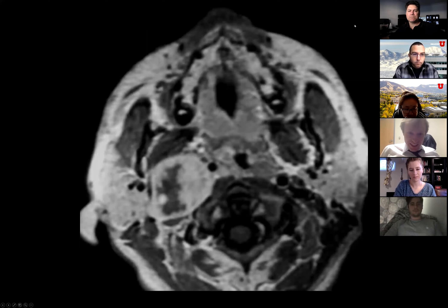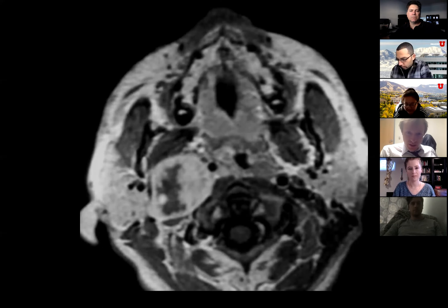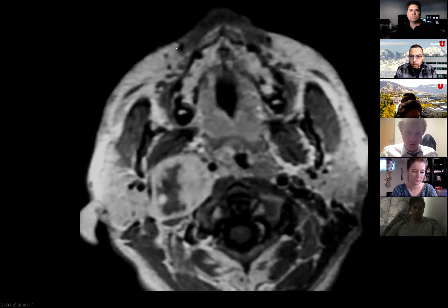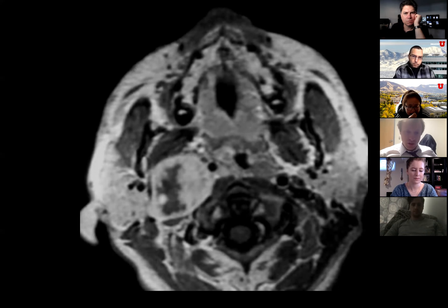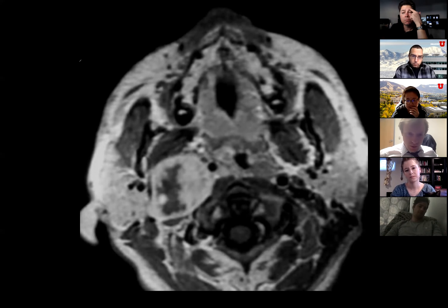Looking at a T1 image, I see a round mass centered in the right carotid space. It has increased signal peripherally and is dark in the center — it's quite large. The differential is a glomus lesion or a nerve sheath tumor. It doesn't have the salt-and-pepper appearance, even though it's T1 — but maybe it's a nerve tumor with some cystic degeneration in the middle.